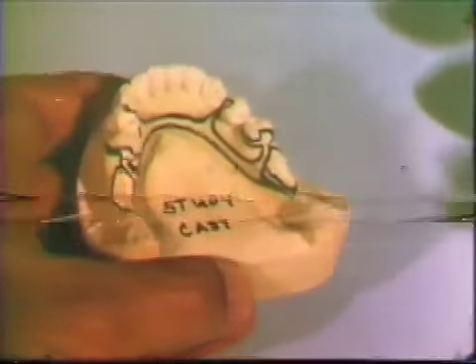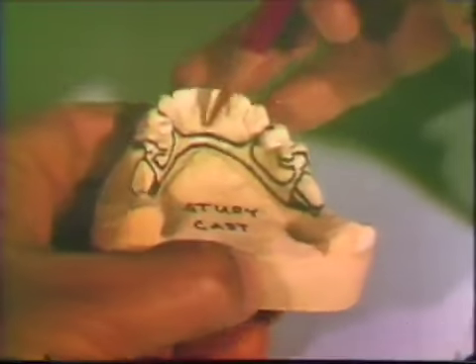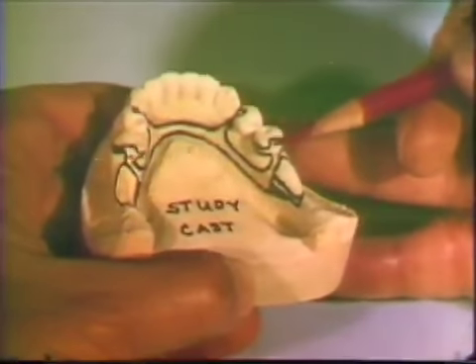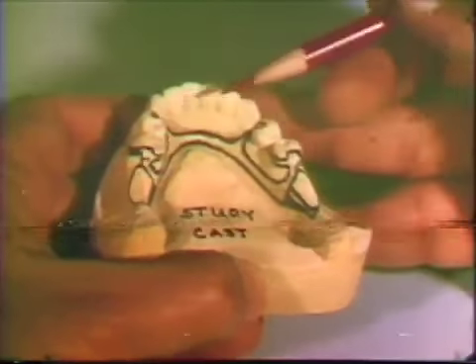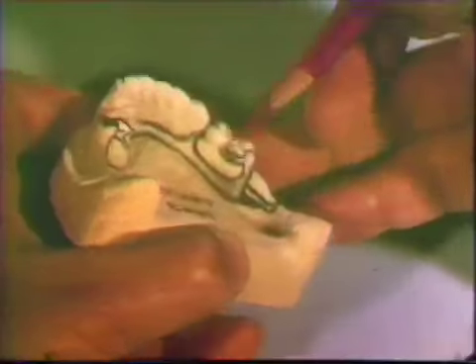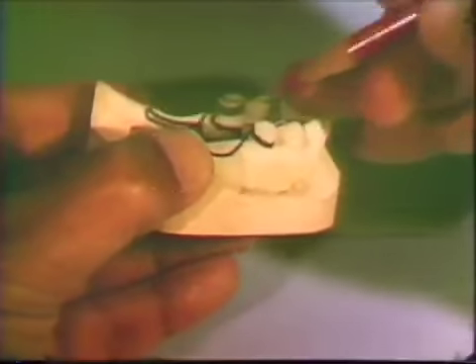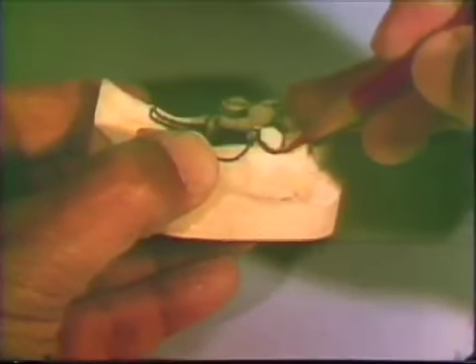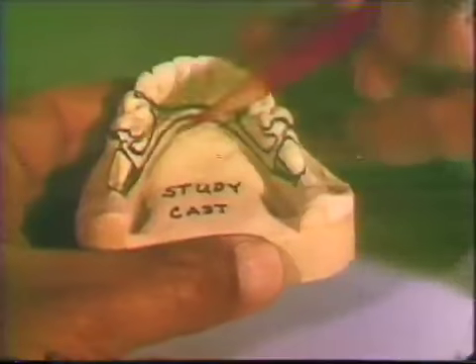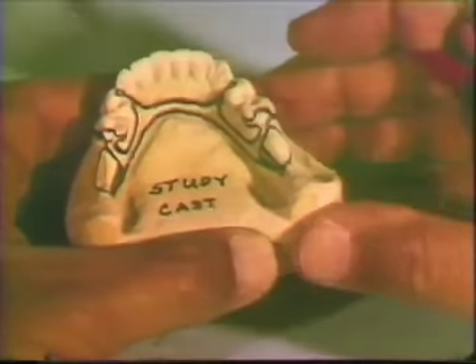The tentative design of the removable appliance includes lingual bar major connector, combination clasp direct retainers, rigid lingual reciprocal arms, resilient 18-gauge wrought retentive arms, and indirect retainers in the form of additional occlusal rests on teeth 22 and 28.